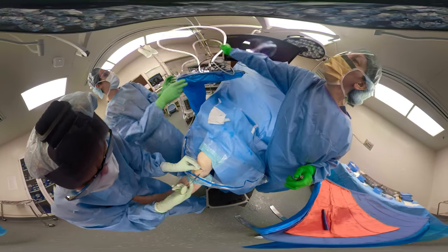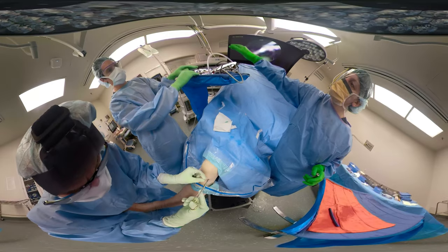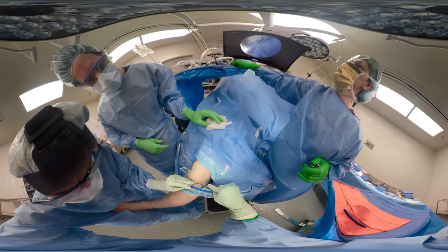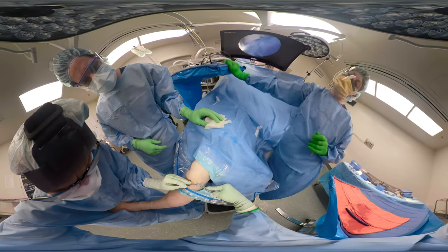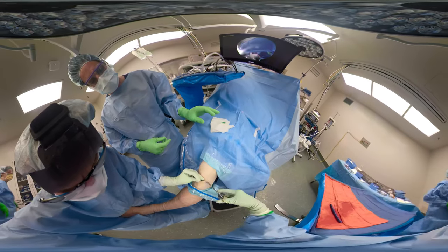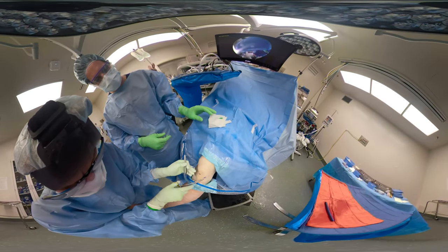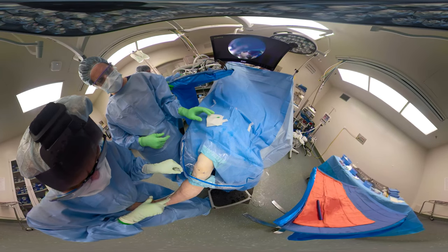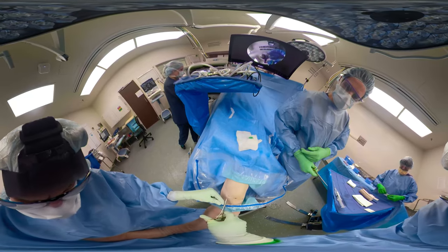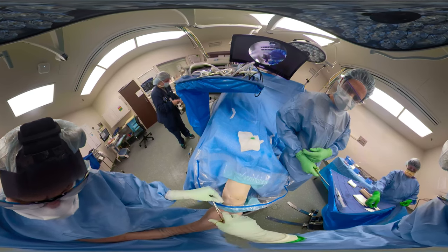I just use nylon because in the past when I've used Vicryl, sometimes they will spit that and it's hard to tell if there's a superficial infection. Close your portals with a mattress suture. Make sure your loop on the top part is far enough apart so it's easy to get the sutures out. Close the medial portal.